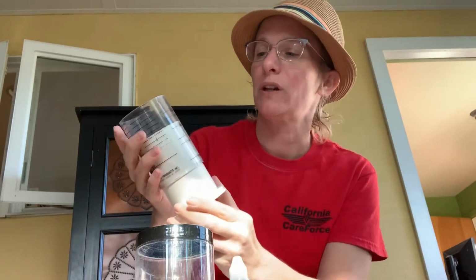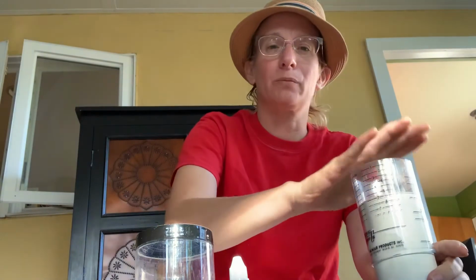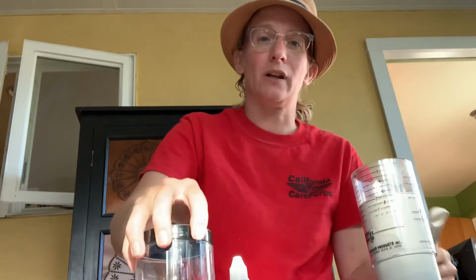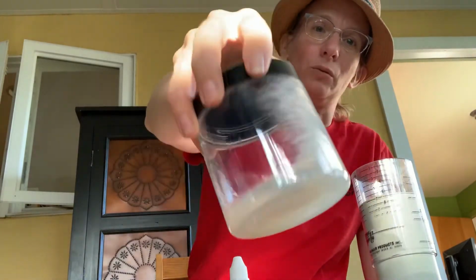Come and get some. Okay, so you're going to get your powdered milk, and you're going to get some warm water. You're going to need 100 milliliters of warm water, which is about 3.5 fluid ounces, not weight ounces, or a bit more than half a cup. Okay, so you would fill this with your warm water, and then you would take a half teaspoonful of the powdered milk and you would mix it with that, and this is the result: you get a really, really thin, milky fluid like this.